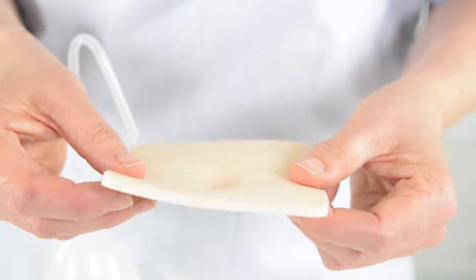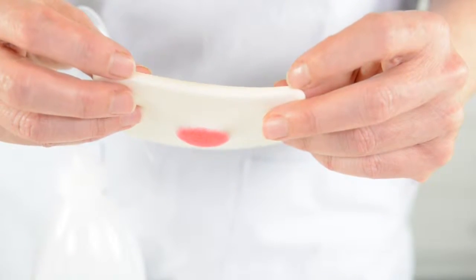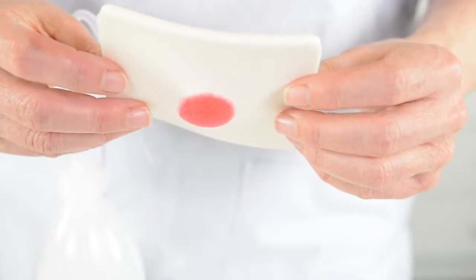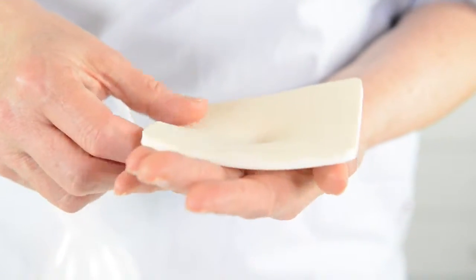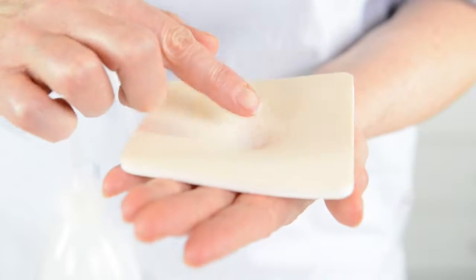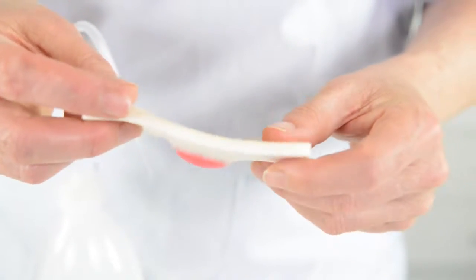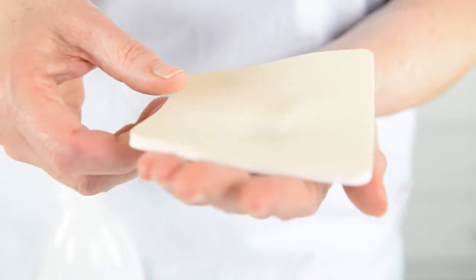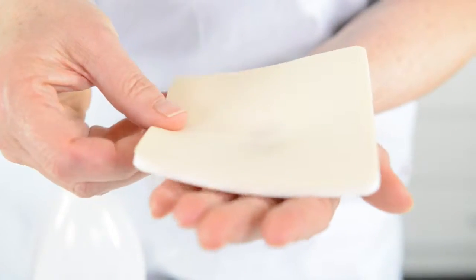Our foam is built up with two different kinds of foams. We have the five millimeter foam — it's a hydrophilic foam, which means that it absorbs the exudate and transports it directly vertically up into the foam and up through the backing. The backing is also a polyurethane foam, but it's a semi-permeable foam, meaning that water will be absorbed by the foam and evaporated through the backing.